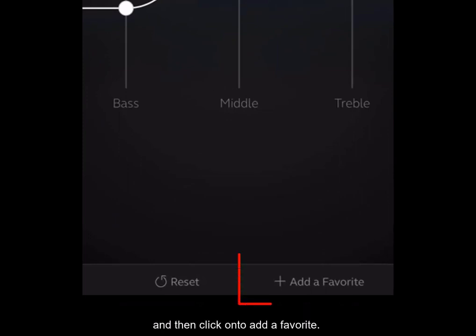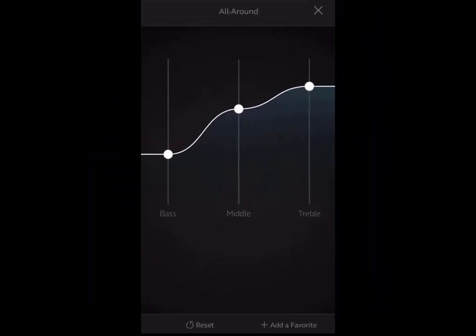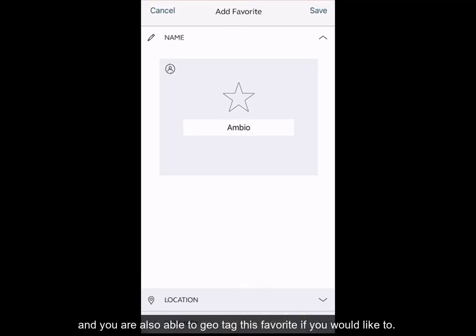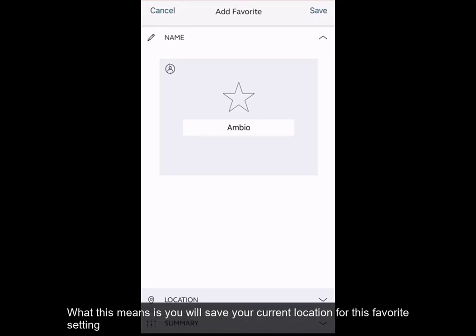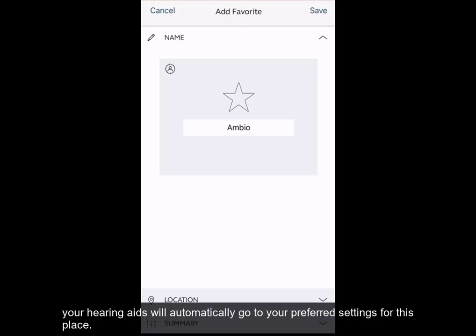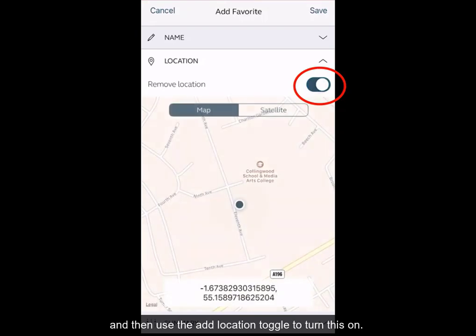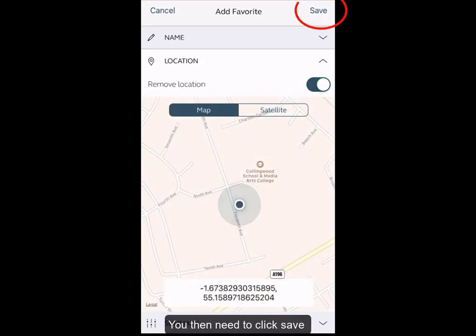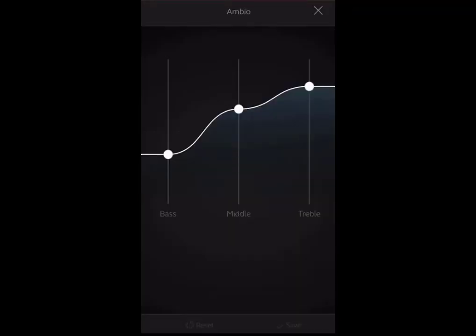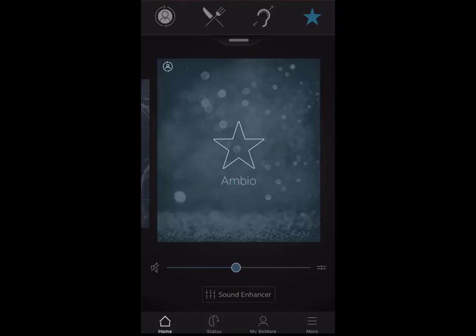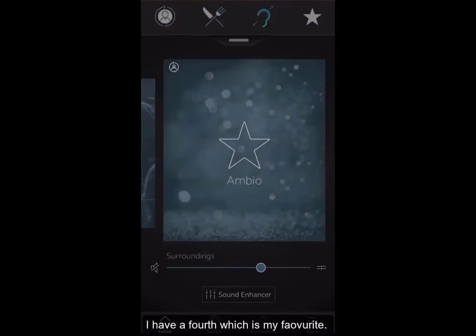Make your changes as you have seen me do and then click on to add a favourite. You will need to give this program a name and you are also able to geotag this favourite if you would like to. What this means is you will save your current location for this favourite setting, and next time you then go to this location, your hearing aids will automatically go to your preferred settings for this place. You need to click onto location and then use the add location toggle to turn this on. You then need to click save, and this favourite will then appear as an additional program — so instead of the three programs I had before, I now have a fourth, which is my favourite.